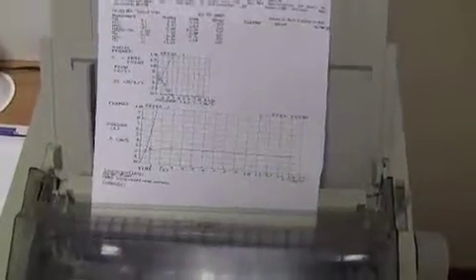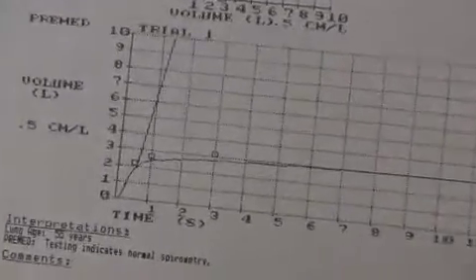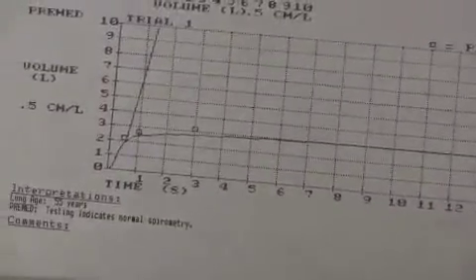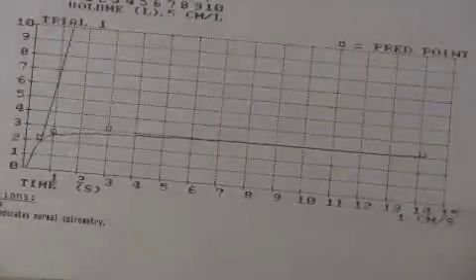Tim's expiration, I'm not sure if you can see the line, but it shows exactly how it's supposed to look. You can see in 1 second almost all his exhalation happened, a good 90%, and usually it'll even be higher. And you can see how much it trailed off with almost nothing for the remainder of the time, but it's important that that be recorded. That shows the normal lung function.